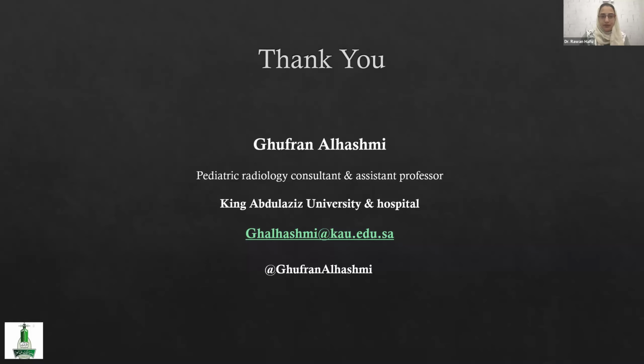All right, next question. Thanks for your great talk. Do you or any other radiologists have experience with giving light sedation, like Valium, to pregnant women before getting in the magnet? Earlier, when the sequences were not as fast, maybe they used to do sedation, but now we don't do sedation just to image the baby, because we use sequences that are supposed to be good enough to freeze the fetal motion.